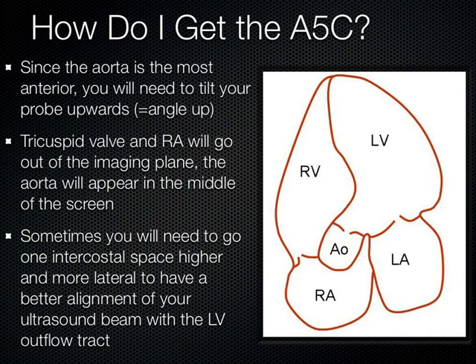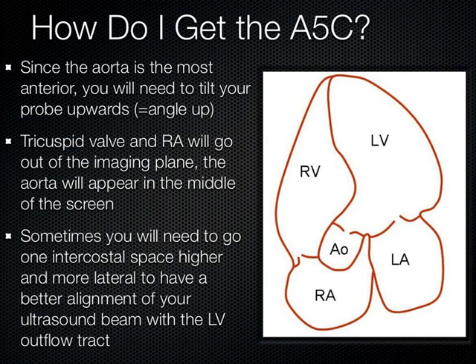Recall that the aortic valve is a little bit more anterior. Once we're in the apical four, we simply fan the probe a little bit more anteriorly, tilt it up a little, and we should see that aortic valve jump to the middle of the screen. The tricuspid valve and right atrium go out of the imaging plane while the aorta maintains itself in the center. Sometimes it's hard in females; you may need to go one intercostal space higher or more superior and slightly more lateral for better alignment. This is all stuff you'll pick up over time practicing.